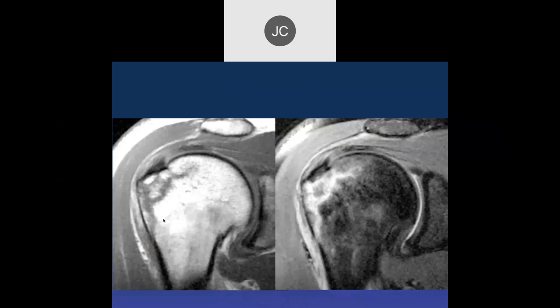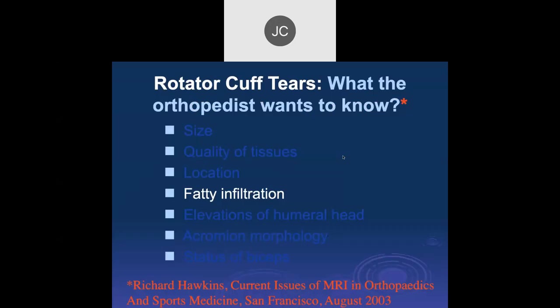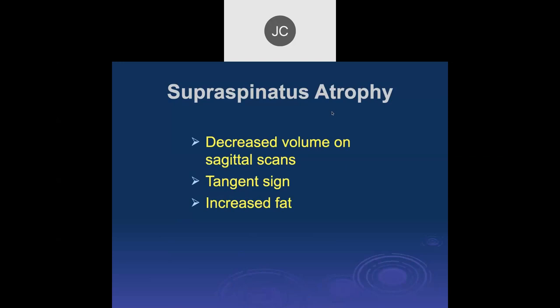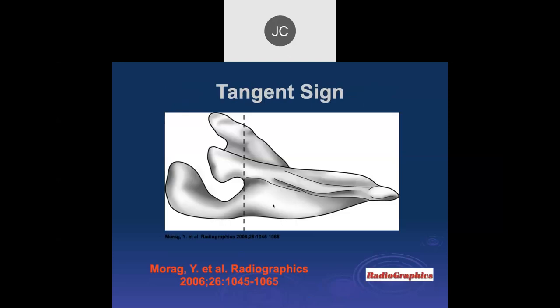Two coronal views show edema in the humeral head without a discrete tear — just a small non-displaced bony avulsion with the rotator cuff itself intact. Regarding fatty infiltration of the muscles: there are several ways to assess supraspinatus and infraspinatus atrophy — decreased volumes on sagittal scans, the tangent sign, and the amount of fat within the muscle itself.